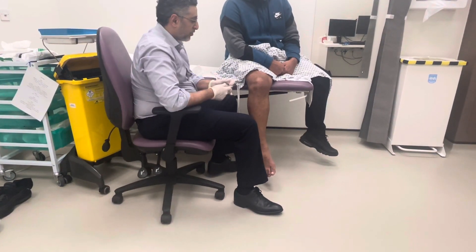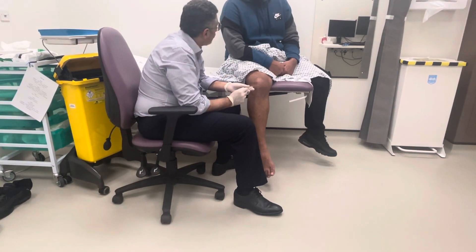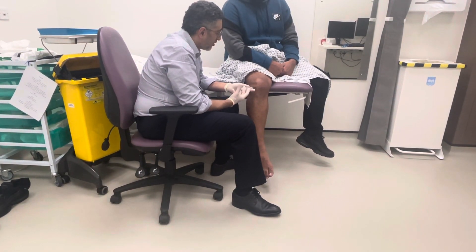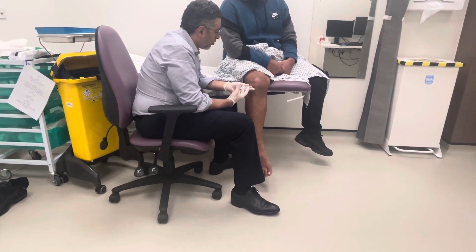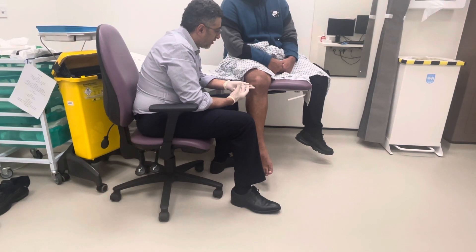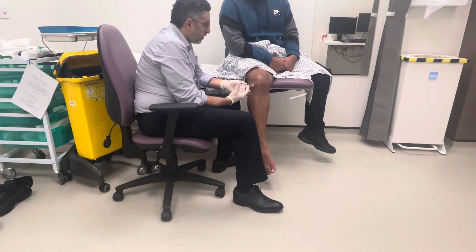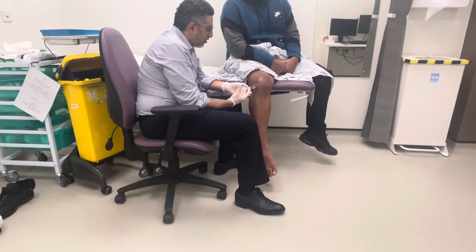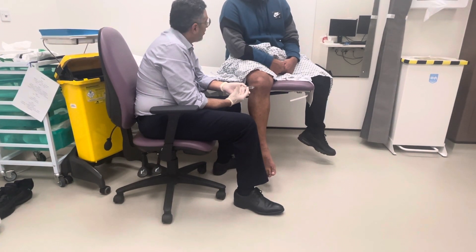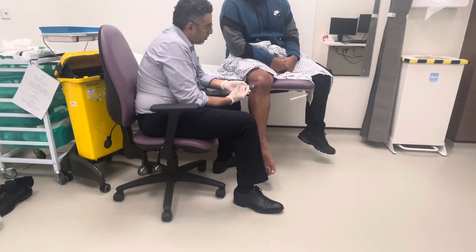I like to give the local anesthetic because it's kind of direct to the patient — it's just like when you go to the dentist. Sharp scratch coming in. Is that okay? Yes. Well done. That's it. That's the worst part. I'm just going to go inside there with a small needle. You can see it does sting a little bit, but once you put it in you're trying to infiltrate inside, and now inside the knee joint, and I'm giving the local. How does that feel? Yeah, it feels funny.